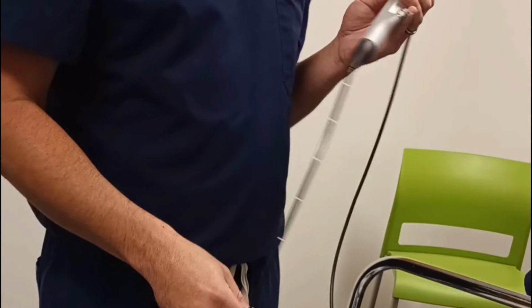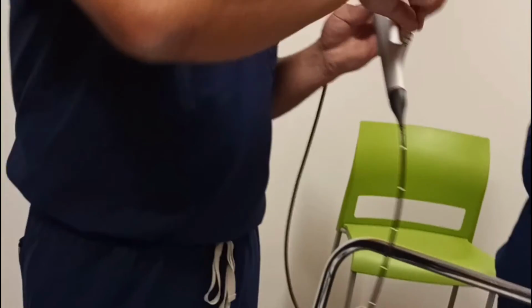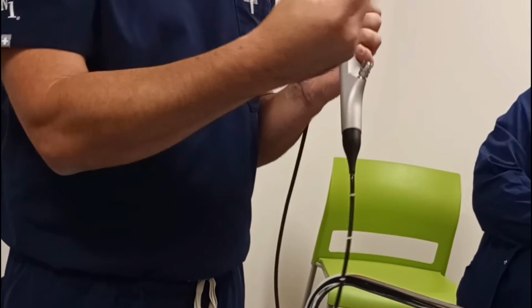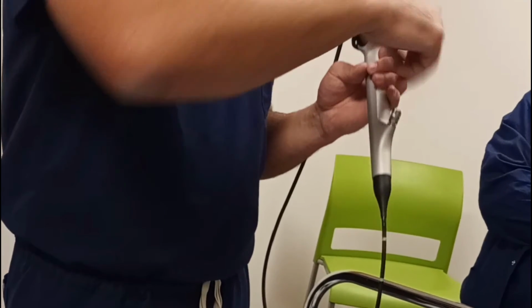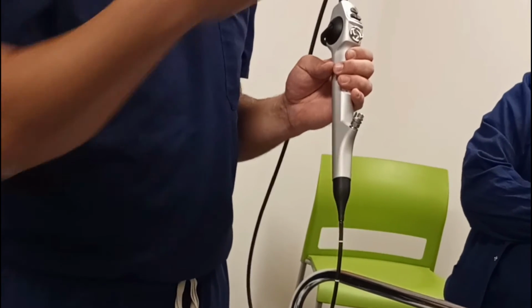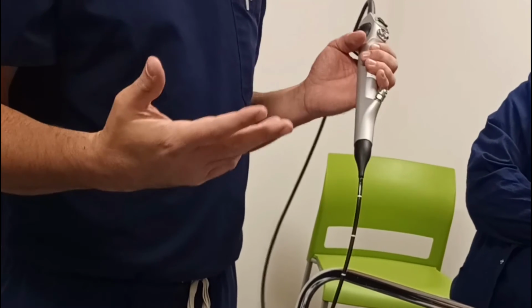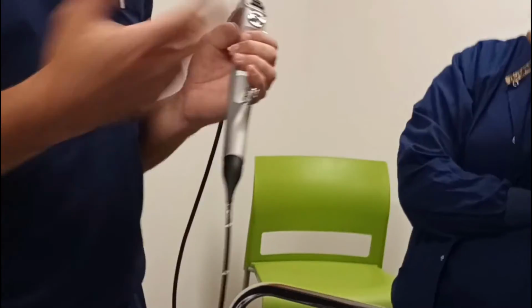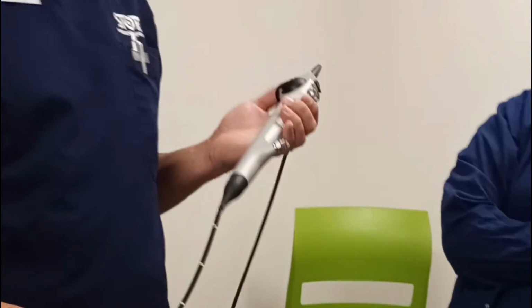All right. So you're going to take your little brush, you're going to push it down, you're going to twist it 360 degrees, you're going to pull it out, you're going to wipe it off, push it back in, minimal of 3 times for each port. If debris is still coming out, you're going to continue to do it until you feel safe to proceed with the next step.